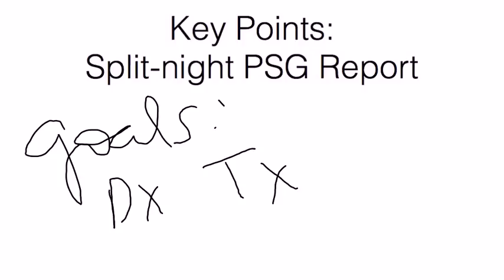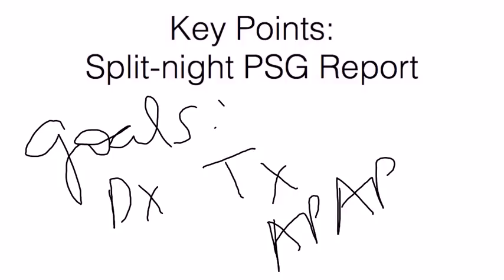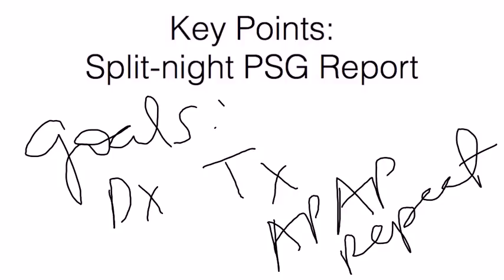And for example, if after the sleep study, the titration shows that the highest pressure tested was still highly inadequate to treat the sleep-related breathing disorders, then two things can be done. One is whether the patient should just be put on auto-PAP after that, or whether the patient should be brought in for a repeat sleep study. So those are the two things that can be considered.